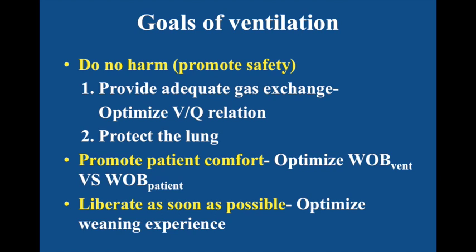So in conclusion, the aim of mechanical ventilation is to assure gas exchange while efficiently unloading the respiratory muscles, and mechanical ventilation is an integrated part of the care of patients with acute respiratory failure.